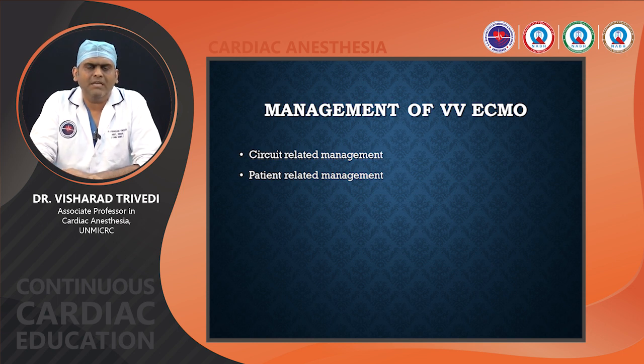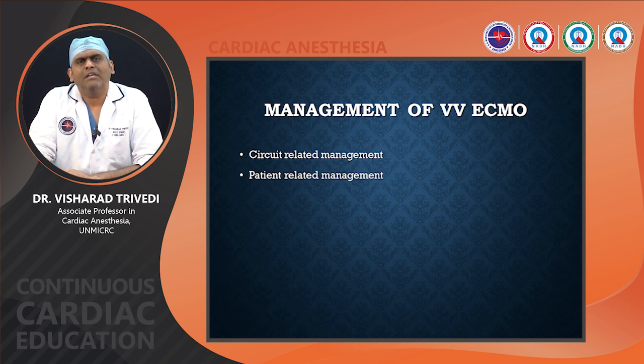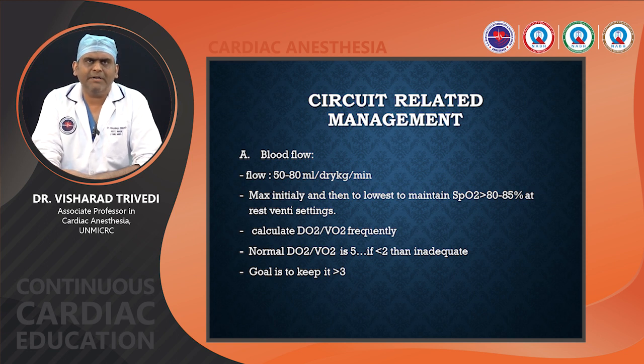Today, after putting a Veno Venous ECMO, it is very important to manage that Veno Venous ECMO as well. So today we learn about the management of Veno Venous ECMO broadly under two headings, that is circuit related management and patient related management. First we'll see the circuit related management.